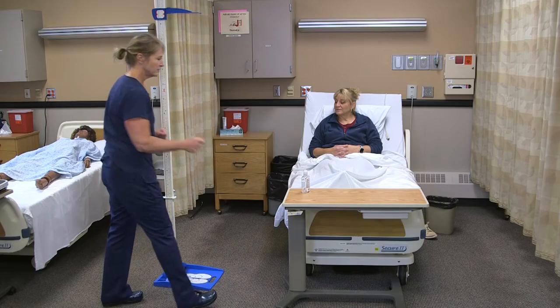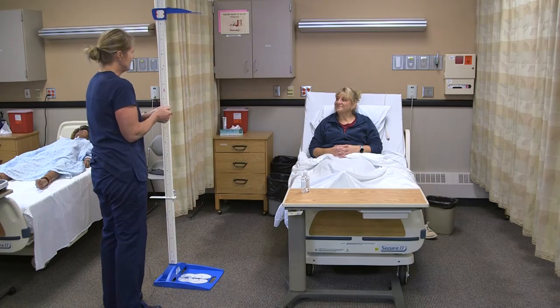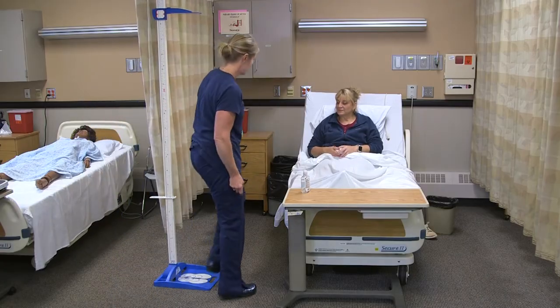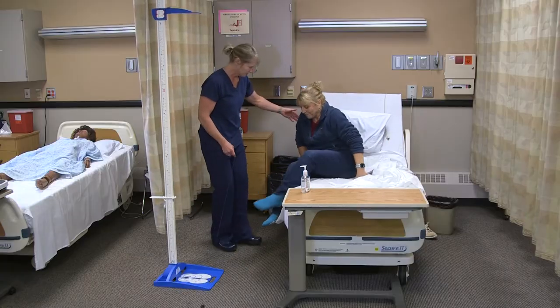I'm going to knock on the door to the room and wash my hands. Hi Annie, I'm Myra. I'm here to take your height — is that okay? I'm going to pull the curtain for privacy. Annie is able to ambulate on her own with just a standby assist, and I see she has her grippy socks on.